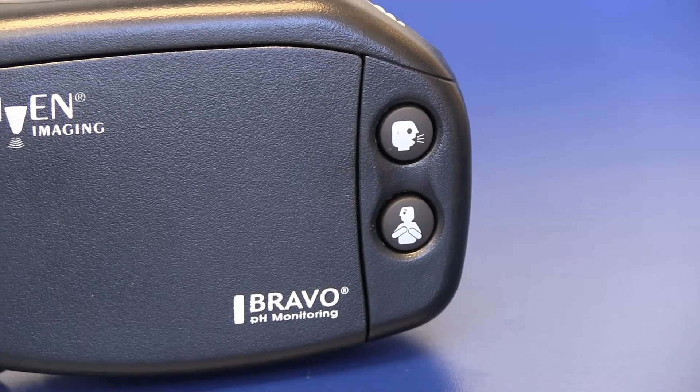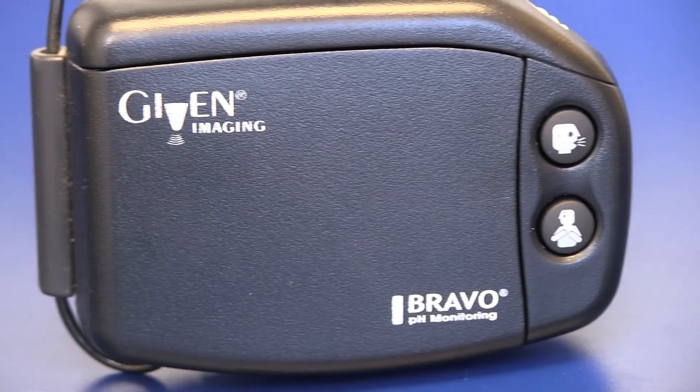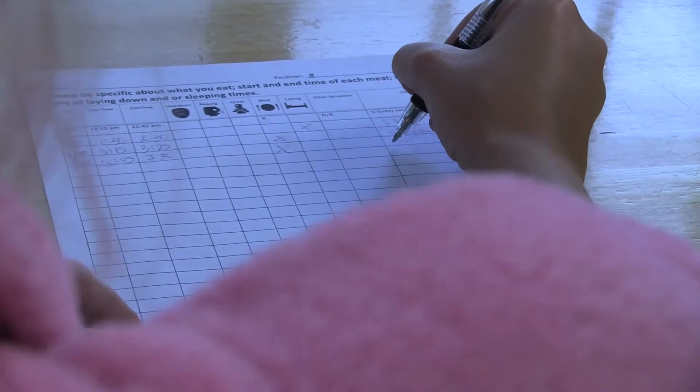It is a 48-hour recording of how much acid is really coming up. In those 48 hours, you will have a receiver and a diary with you. On that receiver, there are several buttons for several symptoms, and on the diary, the doctor wants to know when you eat and when you lay down.